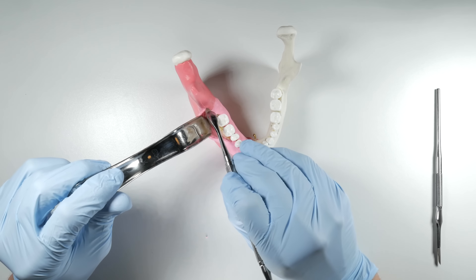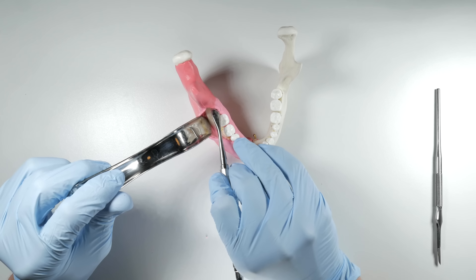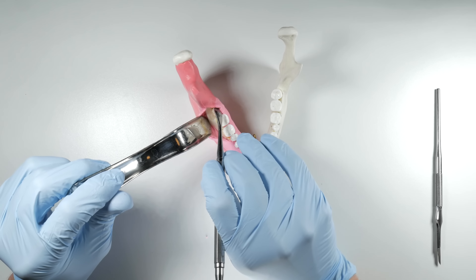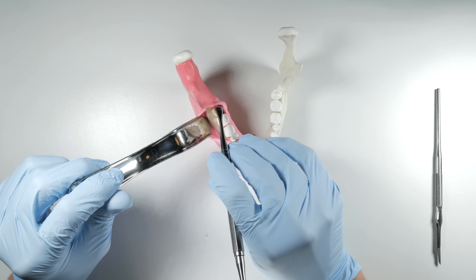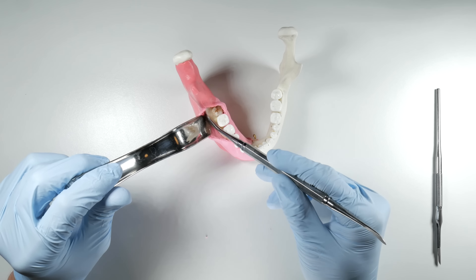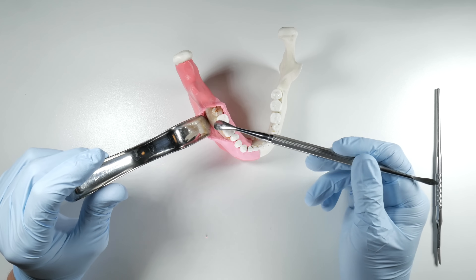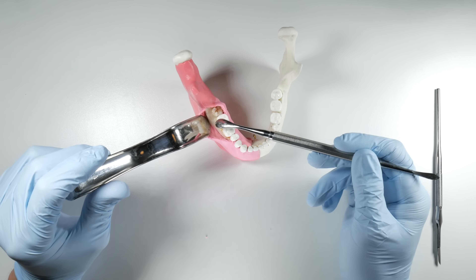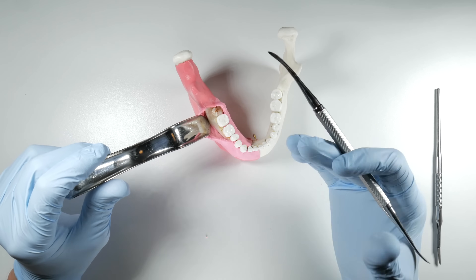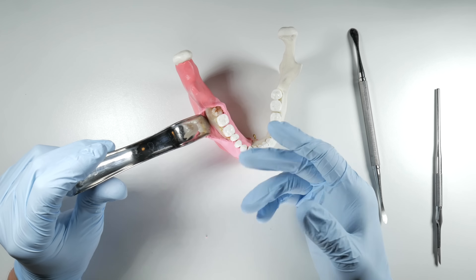Once reflected, you can slip the Minnesota under the external oblique ridge and lean it out posteriorly for great access to the working area. You also want to lift the lingual tissue away using the broad end of the periosteal — get underneath, lift the tissue away, always staying subperiosteal so the instrument remains on bone or tooth the entire time to protect the lingual nerve. With this open, you've got a nice surgical field — a little pocket that collects fluid and shavings throughout the procedure, which your assistant can suction out to keep everything clean and isolated.